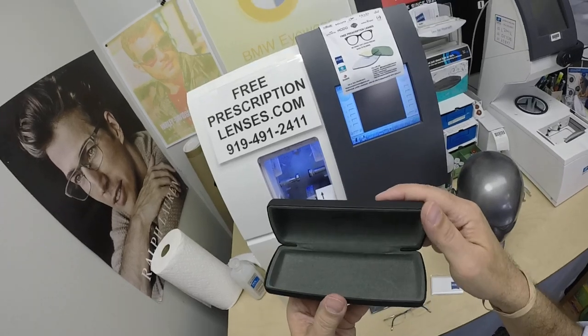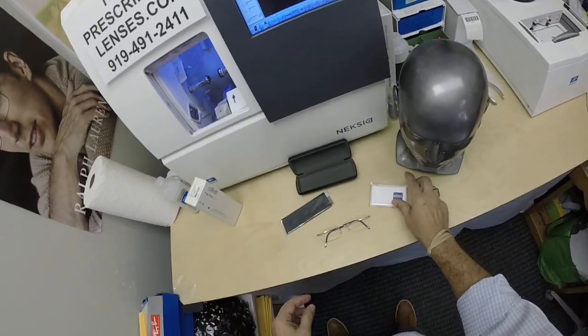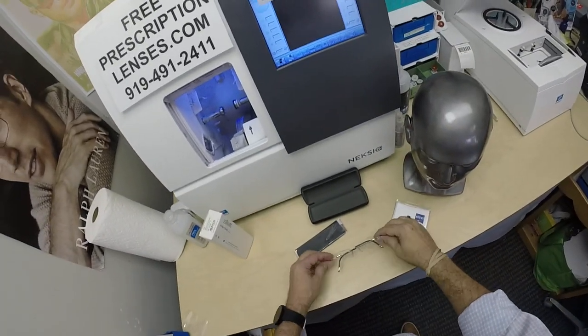You get the hard shell Silhouette case with that, and the Silhouette cleaning cloth. Of course, he got DoorVision chrome anti-glare, so you're also going to get the Zeiss cleaning cloth.